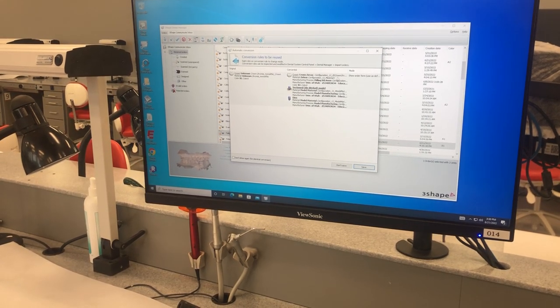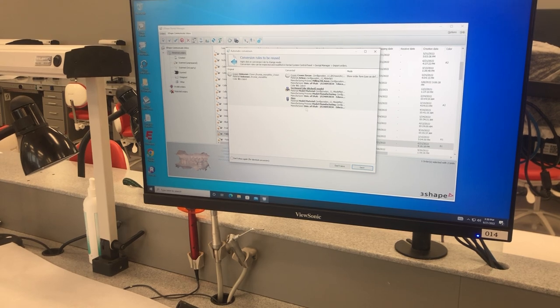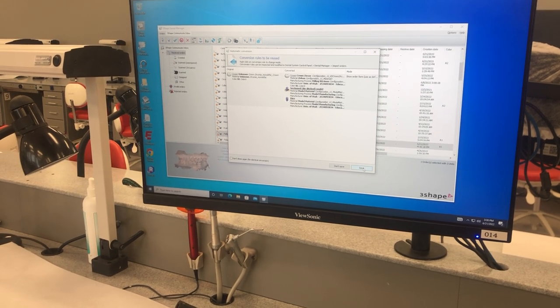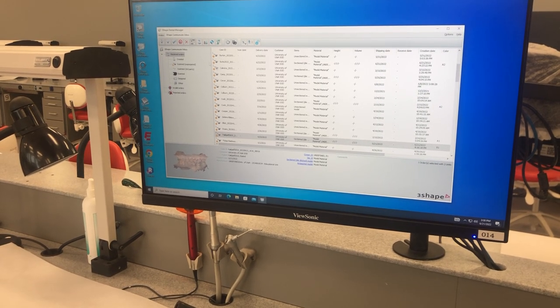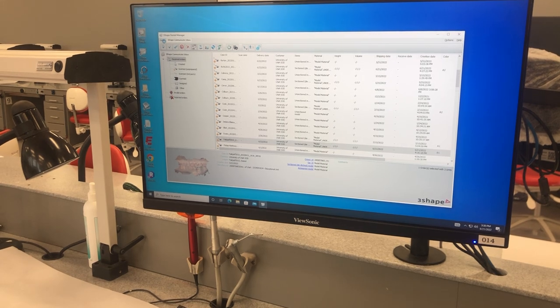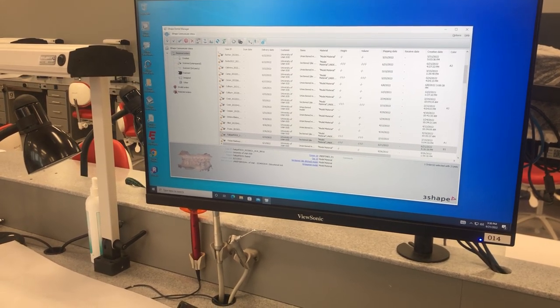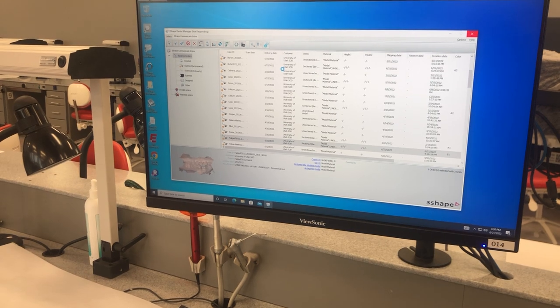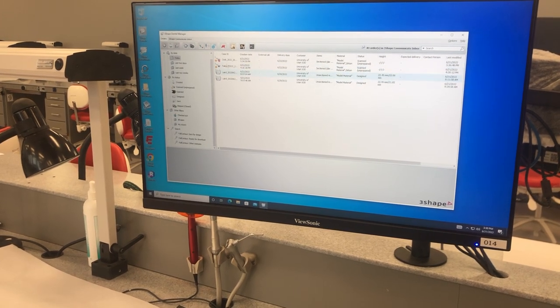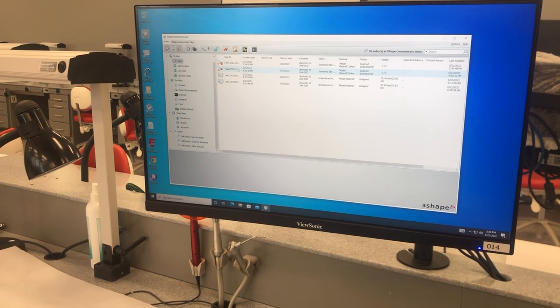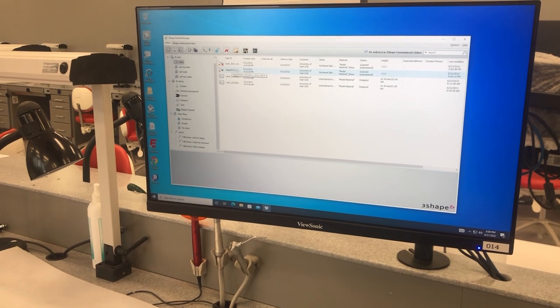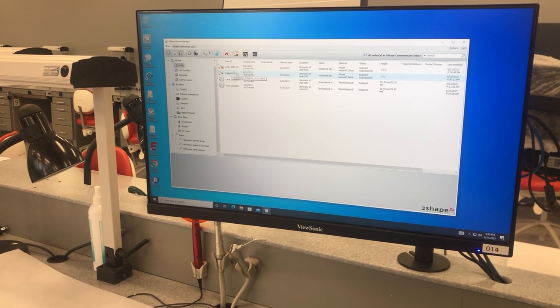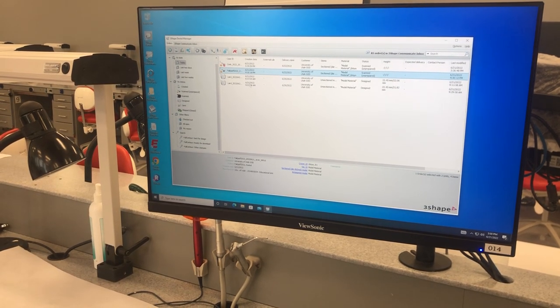And then it tells you it converted your monolithic zirconia crown to a monolithic zirconia crown with a section die and an individual die. That's all fine. Then you're going to click on orders. Orders is our current orders and what's in our system right now, and these are those four cases that are currently there.